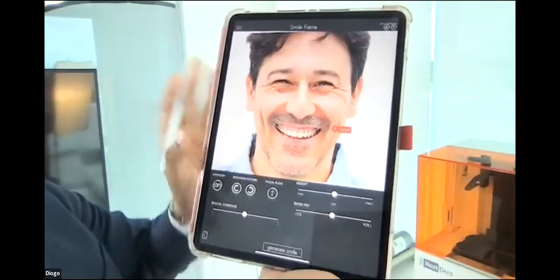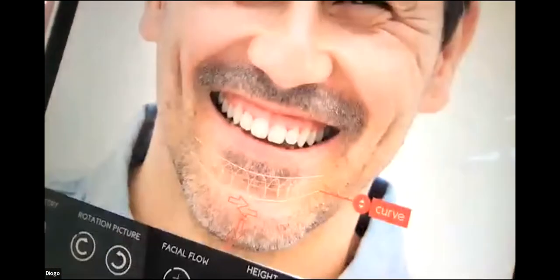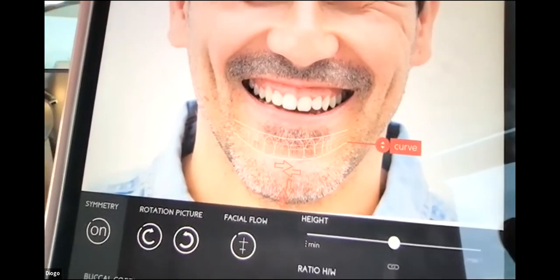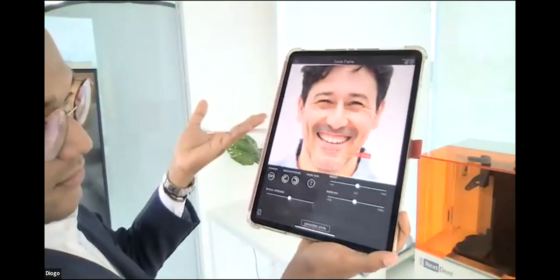So by looking at this patient, you see short teeth, some periodontal issues, gap teeth. And the patient isn't fully confident with his own smile. And I really wanted to show him what I am envisioning for him as a dental clinician.